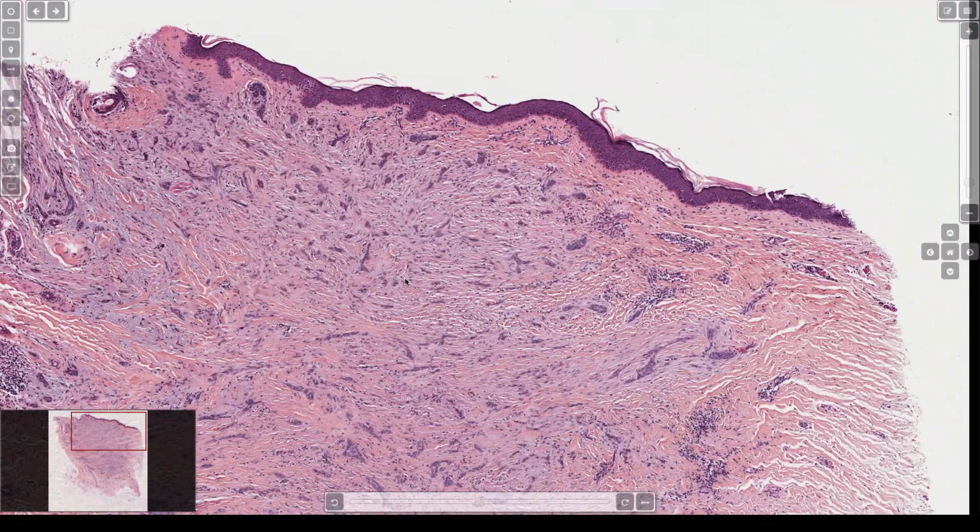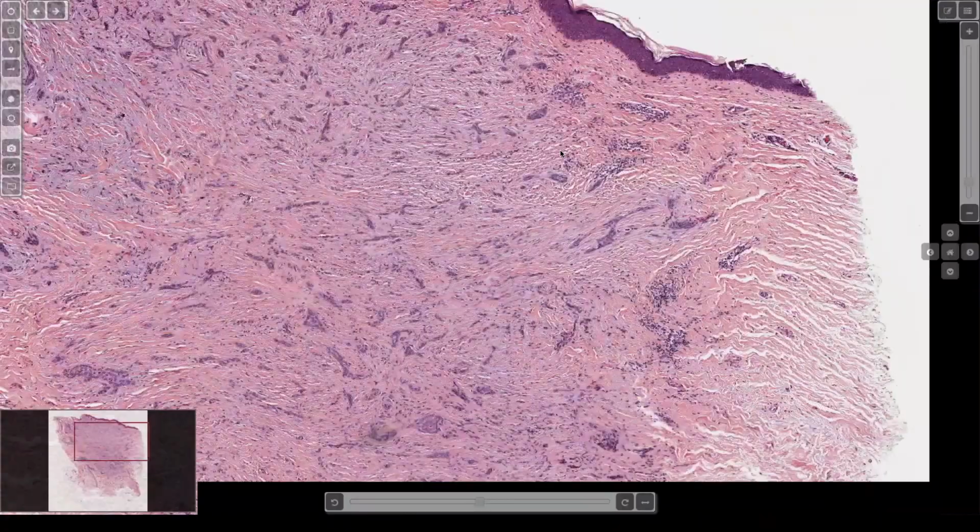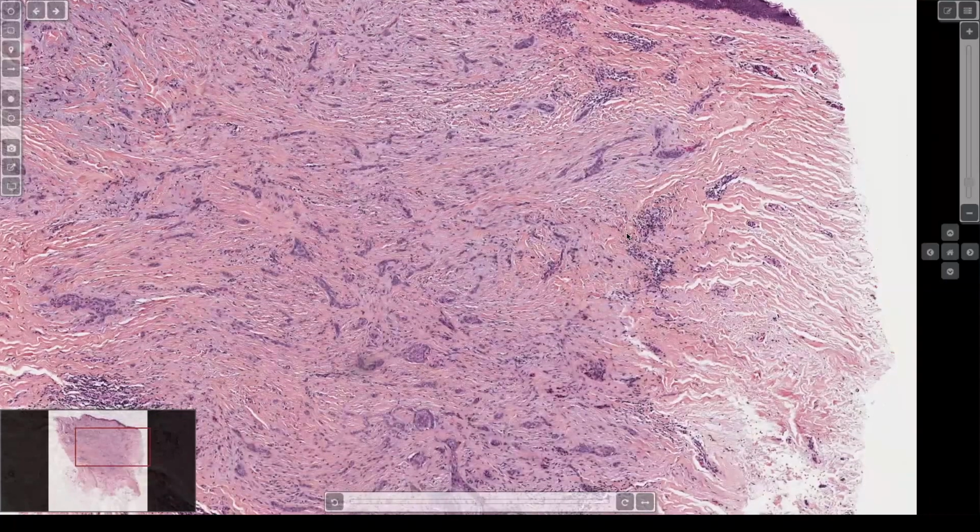When you see these, look for perineural invasion. I find it on a regular basis, a couple times a month. I feel like it's not on people's radar. They probably don't need radiation or anything, but they do usually have to get wider margins, and it takes them longer to clear if they do Mohs. So I usually like to at least comment on it if I find it.